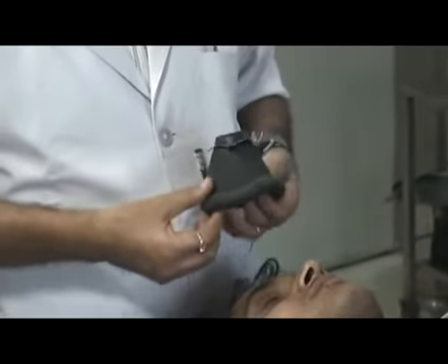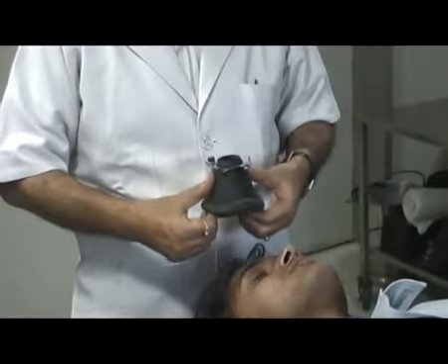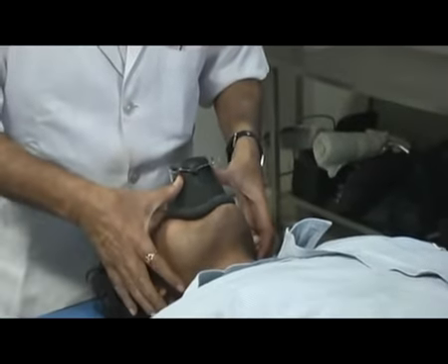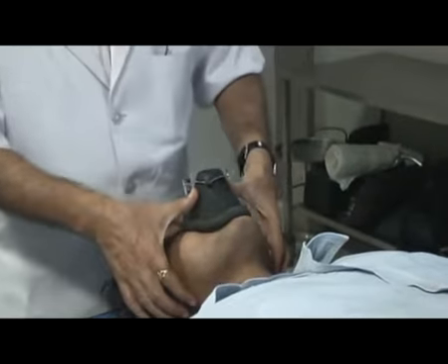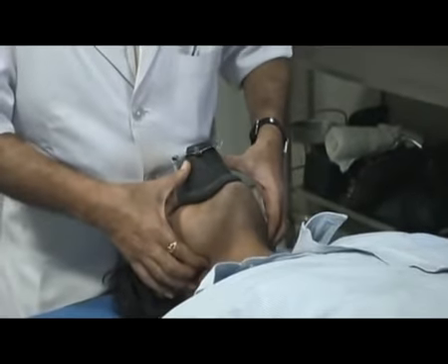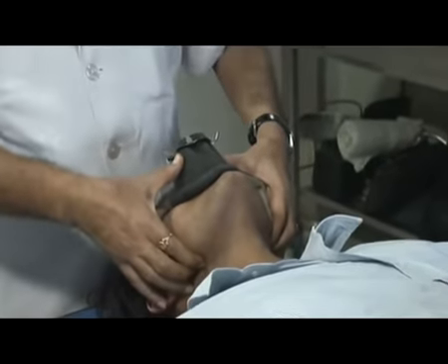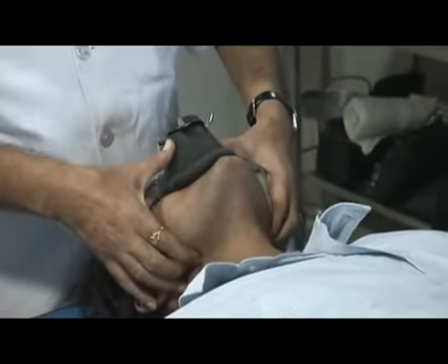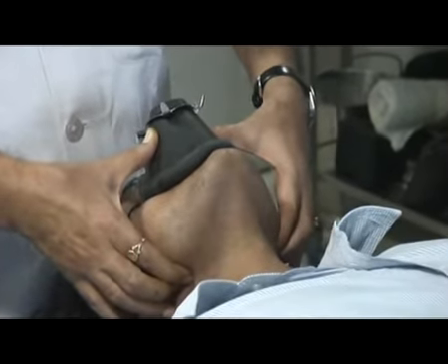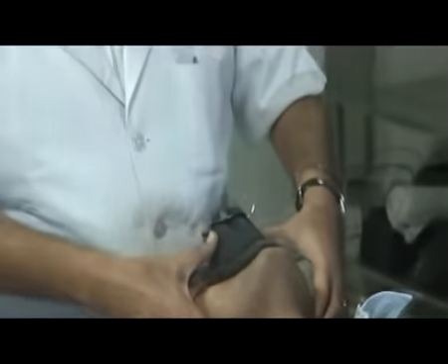In the case of a difficult airway, we hold the mask with two hands. The two thumbs are placed on either side of the mask, exerting downward pressure on the face. The index fingers are placed at the angle of the mandible to extend the head and lift the mandible. When ventilating with two hands, a second person is needed to help ventilate the patient. This technique helps in opening all but the most difficult airways.